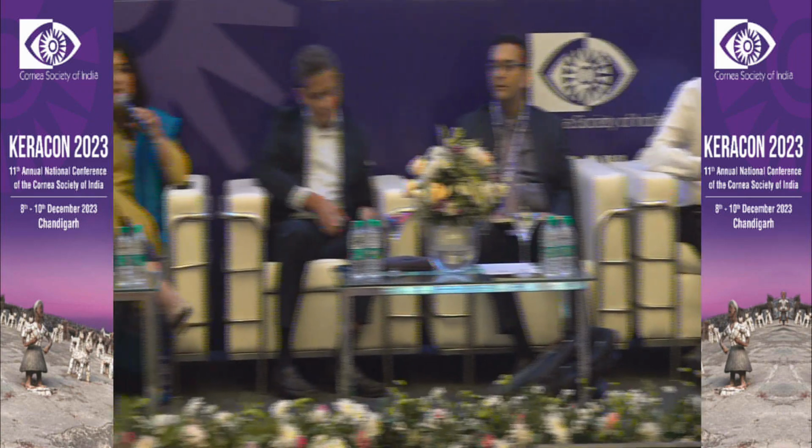That's definitely true. I think all these investigations do add an added layer of safety, but also an added layer of complexity. So depending on the workflow, in abnormal cases one must certainly do them, but in an otherwise regular topography, I think it can be a personal call.